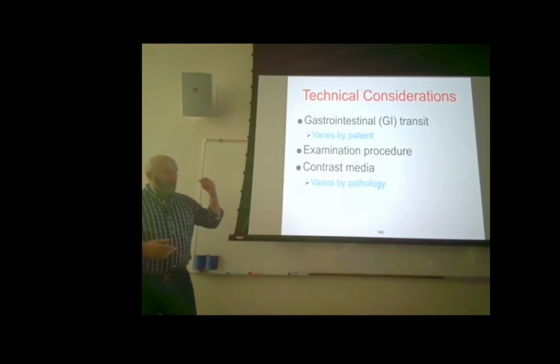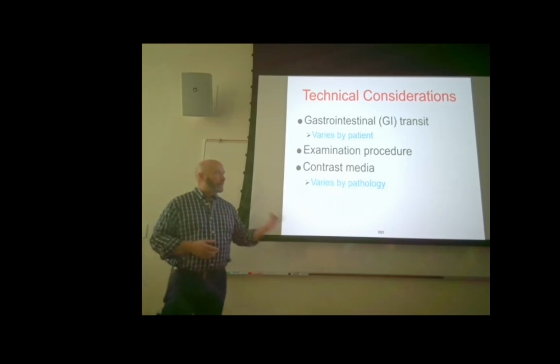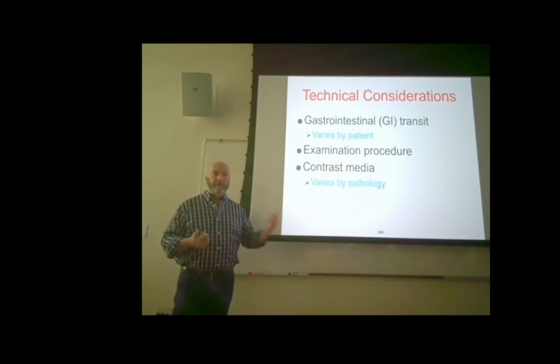But GI transit, how long is it going to take? What can you do to help that along? How long is the patient going to be there? Those sort of things. What type of procedure are we going to use? Contrast media. Contrast media is going to vary by a couple of different things. That is exam type and pathology.